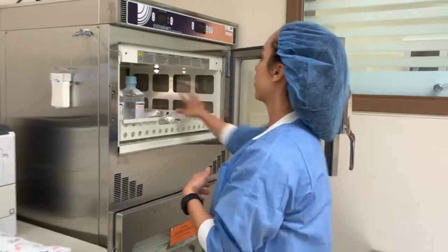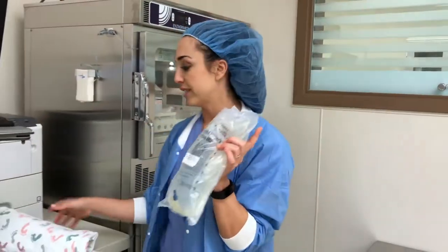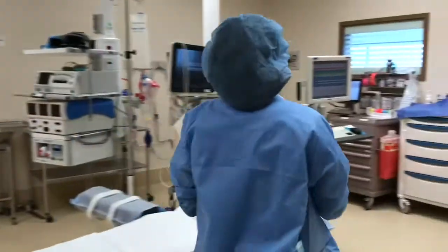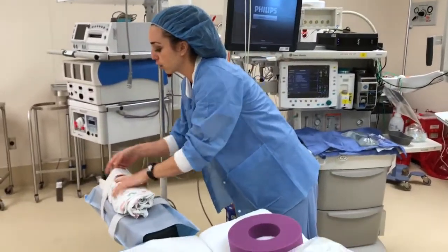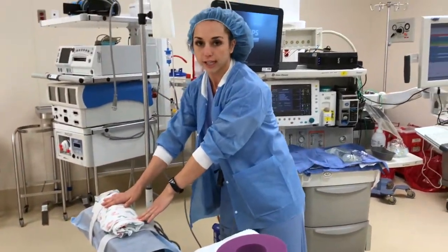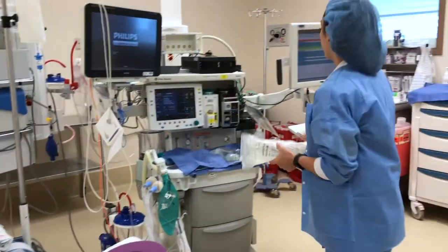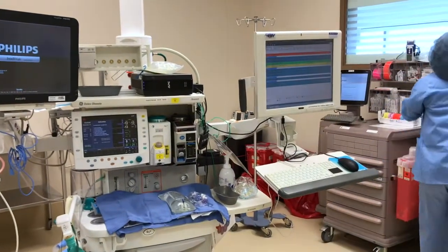And then I grab one of the warm fluids. So it's going to be a warm bag of saline over here. And then I carry them over to our bed. Your baby bump, usually it's nice just to tuck it in over here, and we'll show you when to use that a little bit later. Just put this off to the side so you don't forget about it. And then for your fluid, I'll put that down there.